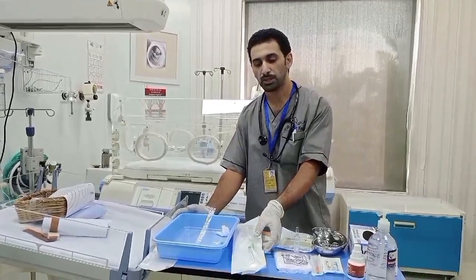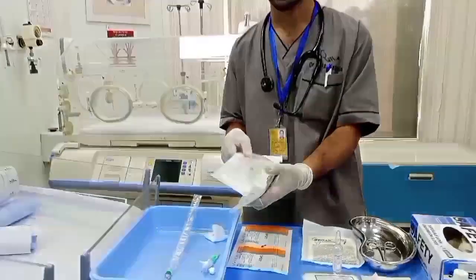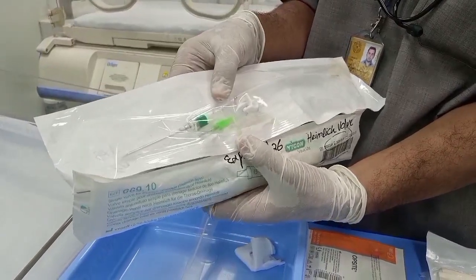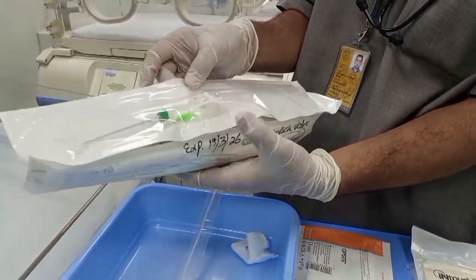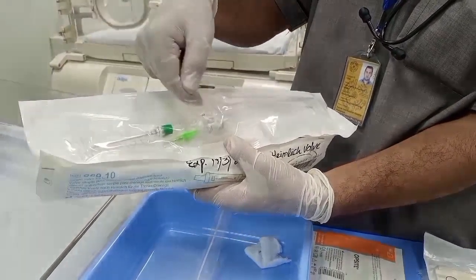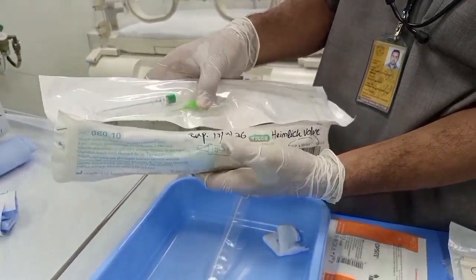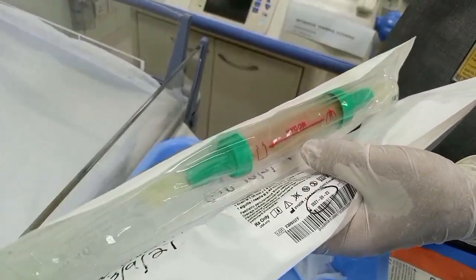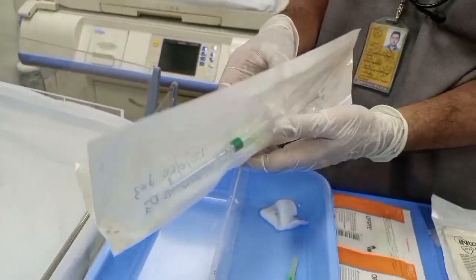These new generation chest tubes save your patient from incisions and dissections. They come with a needle inserter rather than the conventional trocar. This device is called the Easy Drain and is composed of three basic parts: the needle holder that contains the chest tube, the connection gadgets, and the Heimlich valve or underwater seal — either of which can be used to prevent re-entry of air back into the chest.